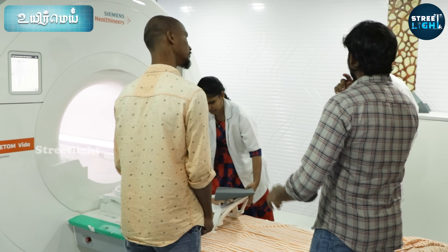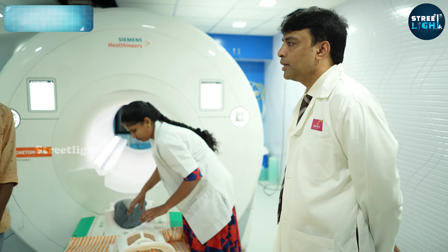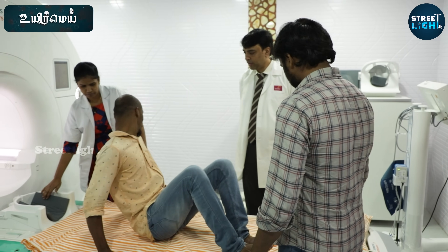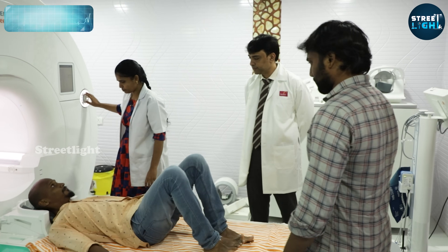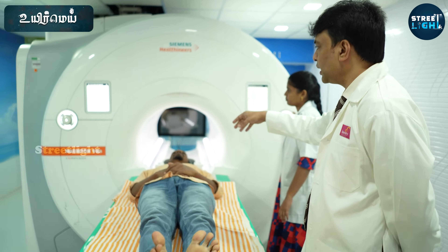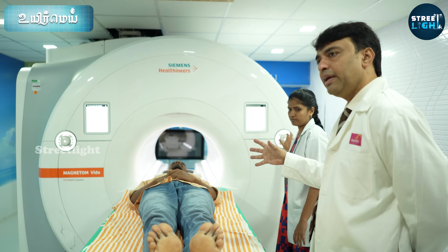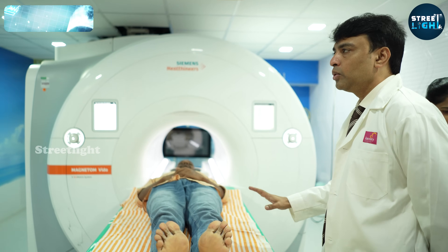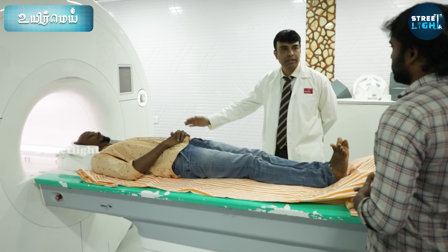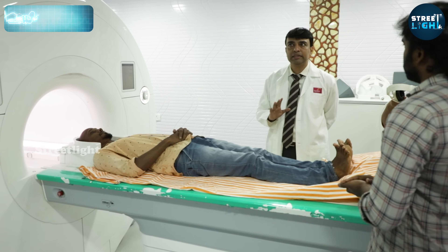We need the MRI scan — we can scan the brain. We can do it in the chest as well. This is a wide-bore MRI. It is almost 70 cm wide. We can accommodate patients up to 200 kg. The standard bore size is 60 cm to 65 cm, and the maximum available is 75 cm. This one is 70 cm.